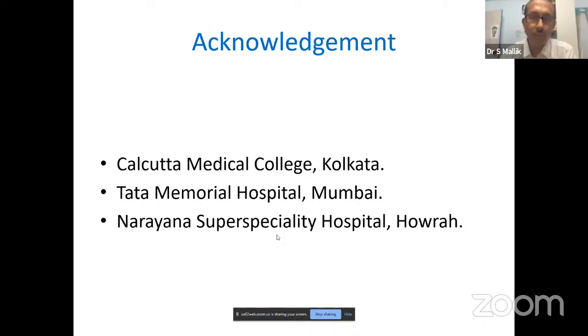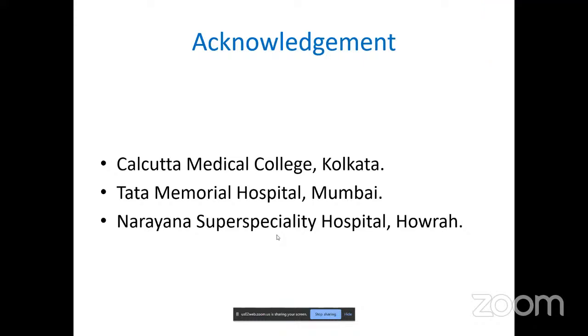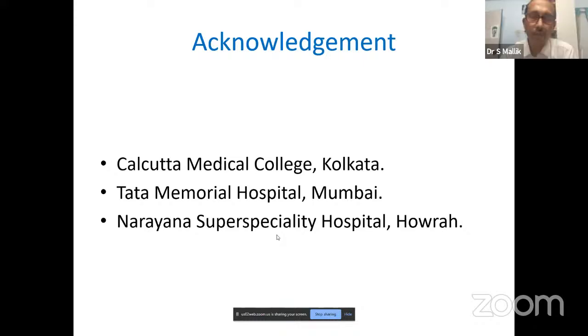What is the clinical planning difference if the retropharyngeal lymph node is positive or negative in taking the upper border in 2D planning? As I mentioned, if you want to treat retropharyngeal, you have to take from the base of the skull, and the posterior border of phase 1 that includes retropharyngeal itself. And you have to be very careful while taking phase 2 when you are making it anterior.